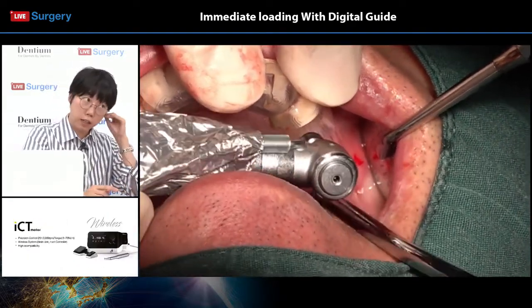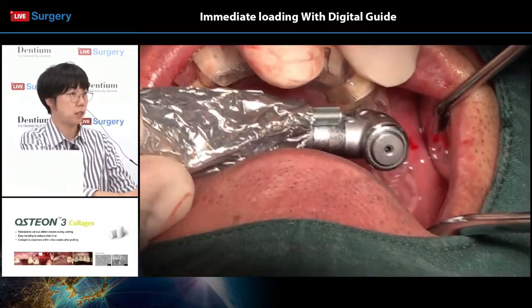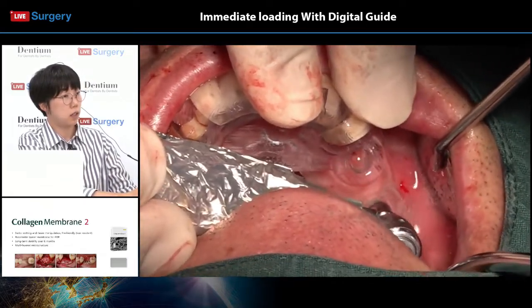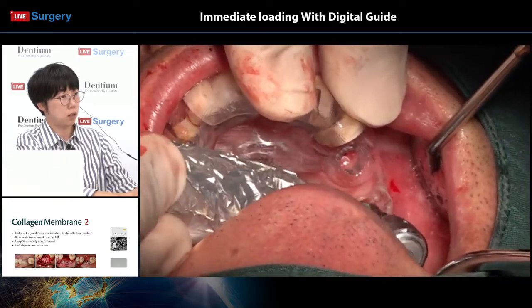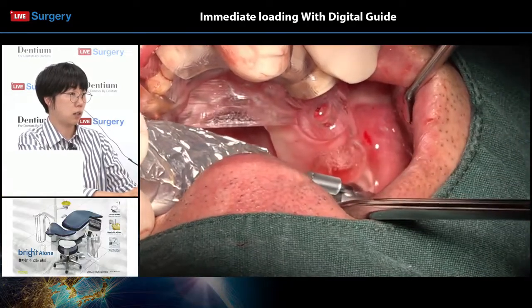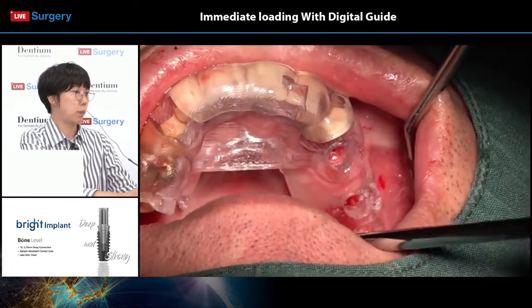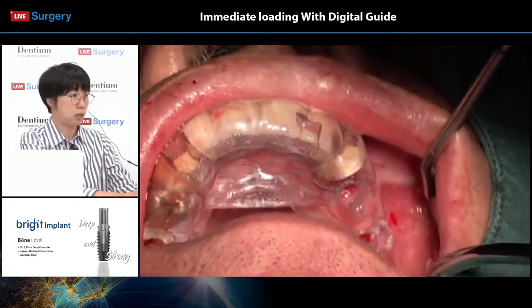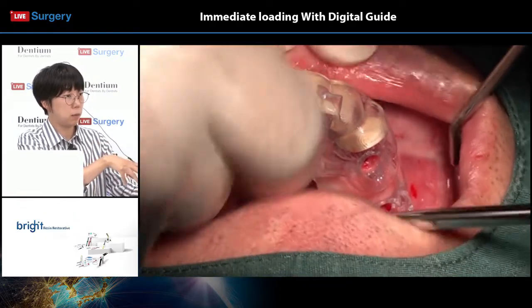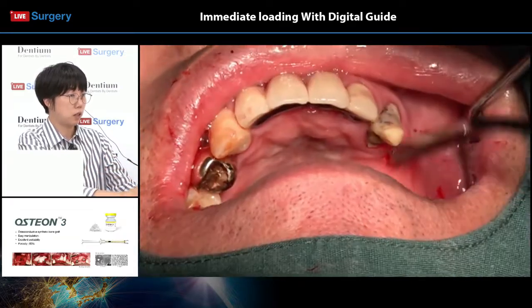Okay, we're back, and Dr. Lee has just started surgery on the upper left side. Dr. Lee has mentioned that he doesn't use a tissue punch drill. Rather, he just uses the conventional drilling, the implant preparation bone prep drill for the start of the implant. So first, he is performing the initial drill that penetrates through the gums and with a shorter length compared to the final length of the implant.